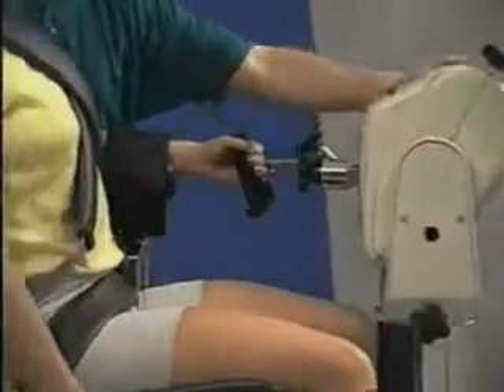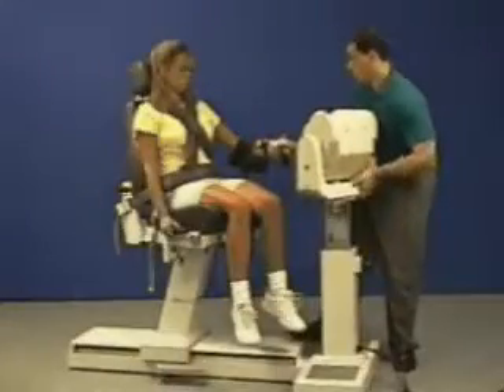Move patient in, make any necessary adjustments, and set range of motion stops.